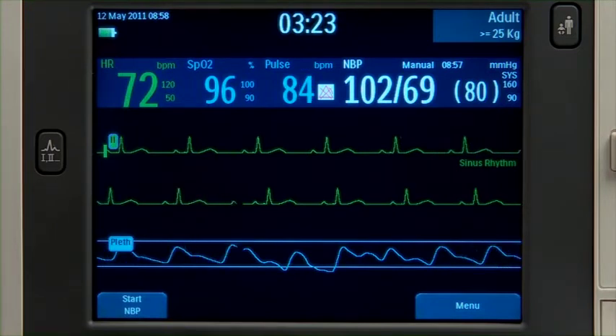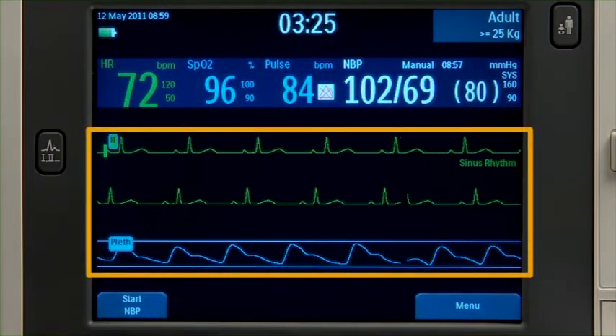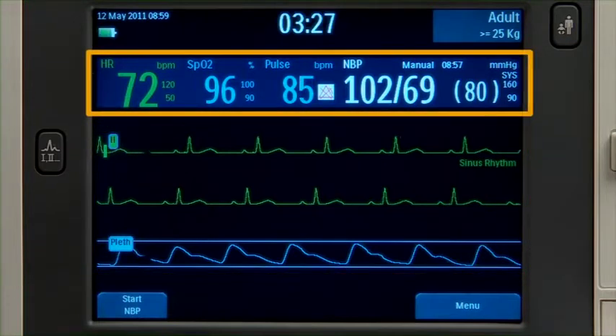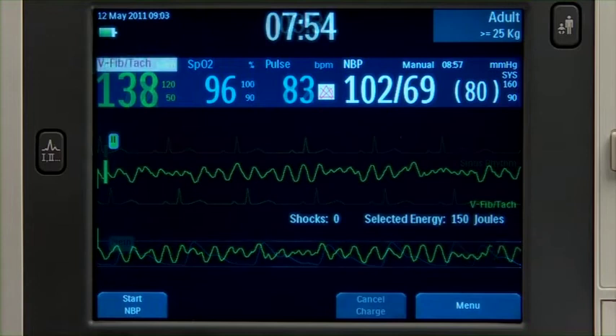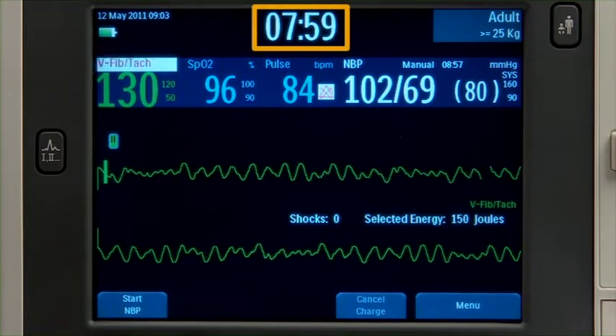In monitor mode, the display includes three wave sectors and a parameter block with related measurements. In manual mode, the screen displays an enlarged ECG waveform and event timer.